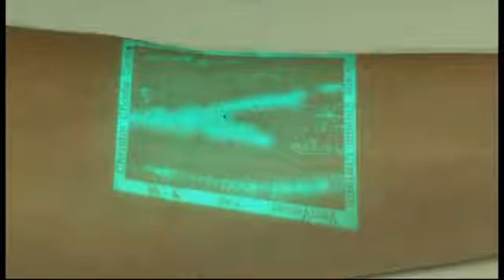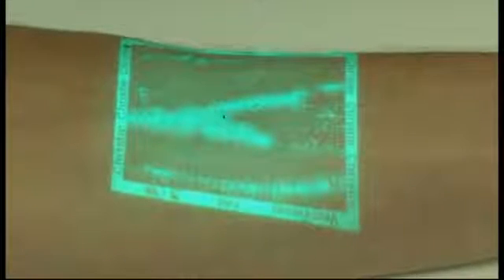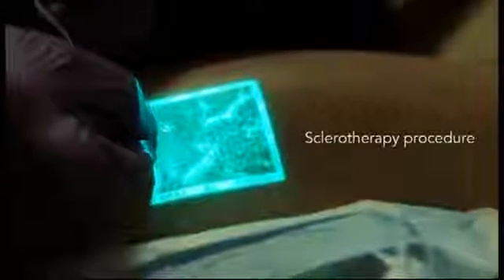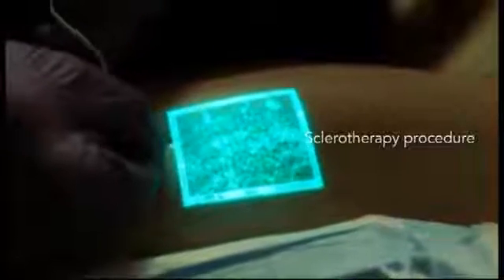Fine detail further enhances vascular structures to highlight small vessels. This is useful for pediatric and neonatal patients and sclerotherapy procedures.